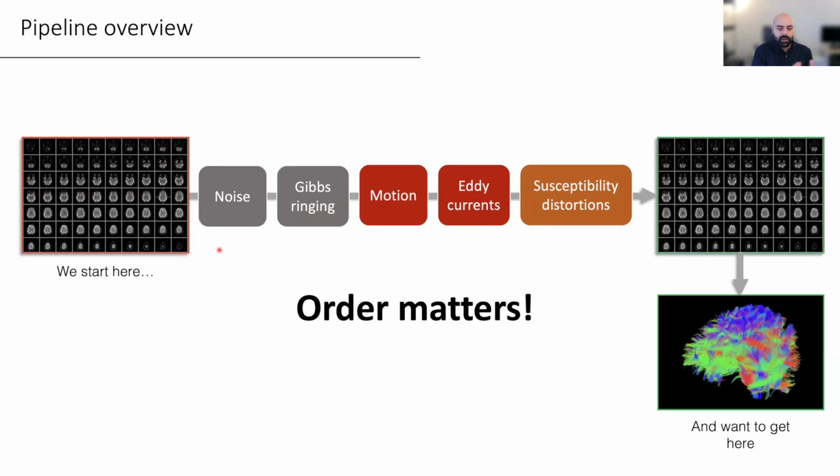But then they apply this thing afterwards that upsamples the image within the acquisition slice. So now you will have data that might appear as 1.5 by 1.5 by 3 millimeters. And if you don't know that the data was set up this way, you would think that the acquisition at the origin was done at 1.5 millimeters in each X and Y axis. But that's not the case.